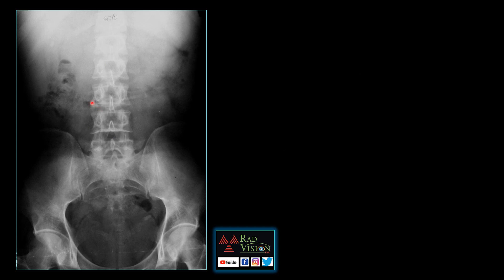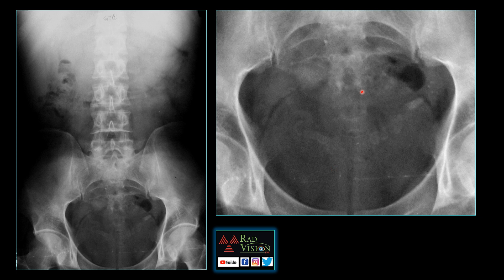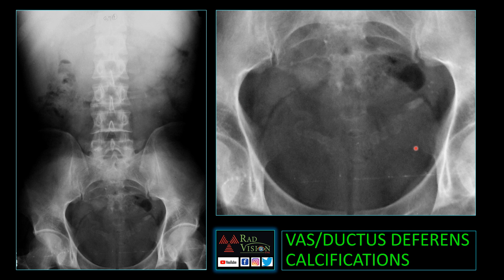Next case: this patient is also a diabetic. Incidentally, we can see there are faint curvilinear calcifications noted extending from the lateral to the medial aspect in the pelvis — and this is the bladder. These are nothing but vas deferens or ductus deferens calcifications. Vas deferens calcifications are faint calcifications along the vas deferens and in the seminal vesicles which are commonly missed. Try to concentrate in the area of the pelvis in seminal vesicles and vas deferens areas, especially in a diabetic.